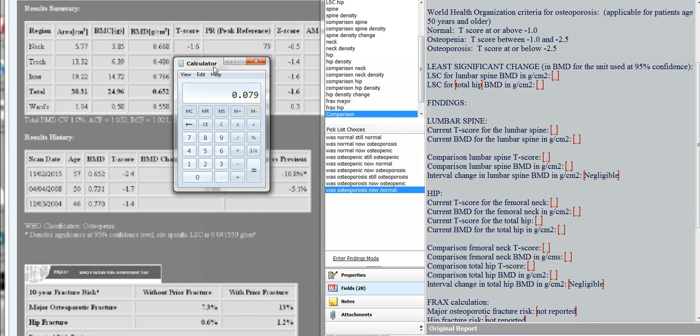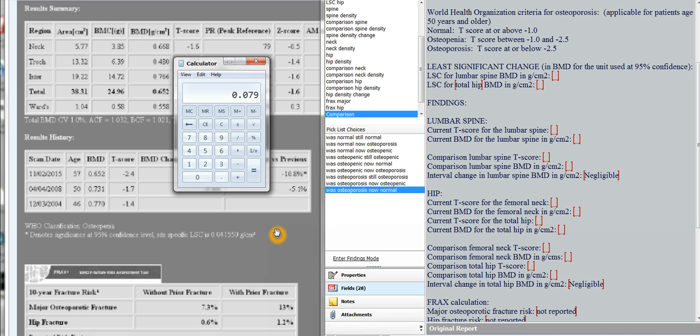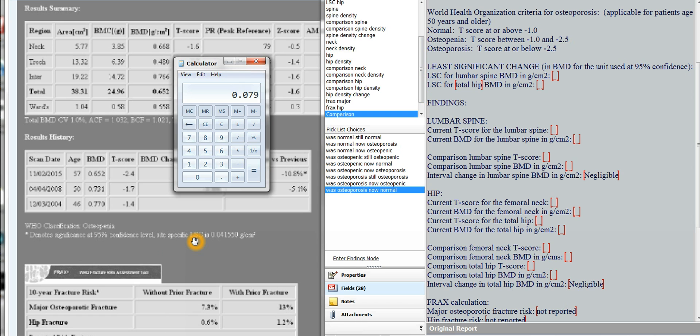So you report that out over here in our template, we would say interval change in total bone mineral density is, and I would put in there 0.079. And then later we can also, in the impression report, in this case, I would use the hip as the reliable measurement, I would discard and I would not use the lumbar spine measurement, I would just put up on here, I'd delete all that and say lumbar spine is not reported due to technical limitations from degenerative sclerosis. My impression would be that there has been a statistically significant decrease in the bone mineral density with a decrease of approximately 11 percent compared to 2008. And then I would make a note that I used the hip for measurements because of the degenerative sclerosis in the lumbar spine.